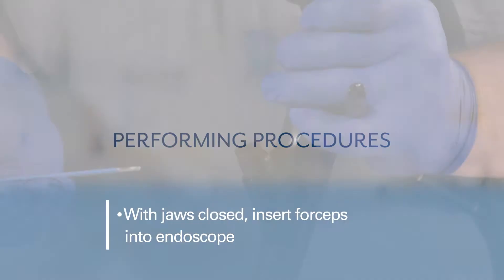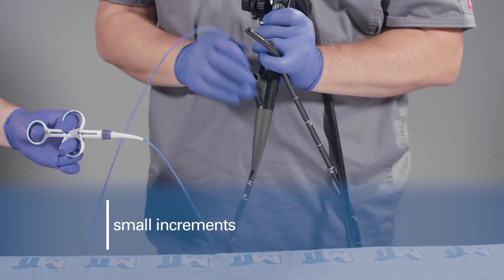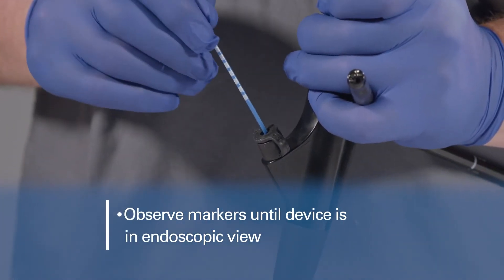With the jaws closed, insert the forceps into the accessory channel of the endoscope. Advance the forceps in small increments. Observe the markers until the device appears in endoscopic view.